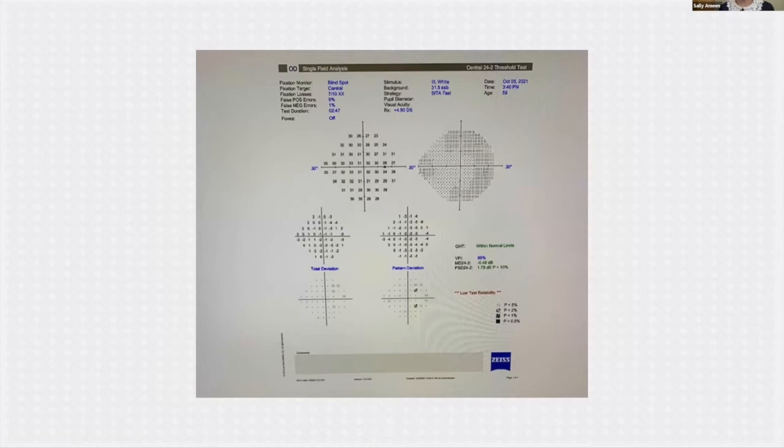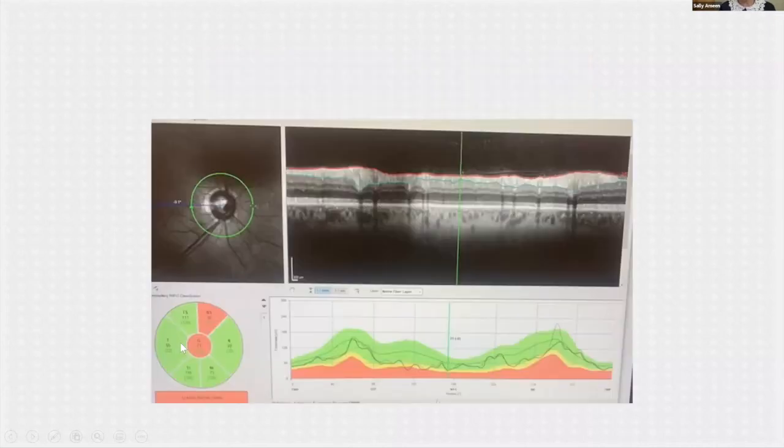So again, this is a gentleman that came in, pressure was above normal on topical treatment with a double agent. Their pressure was running at 28, despite them being on COSOPT. He hated the drop, it made the eye very stingy, very uncomfortable. People started talking to him about surgical intervention very early on. The vision is 6/6. He otherwise is completely fit and well, and he's in his 50s, so he's quite young, 59 just there. So again, when you look at that visual field, you've got more room for maneuver before you start talking about surgical intervention, but you can see there is some disc damage.